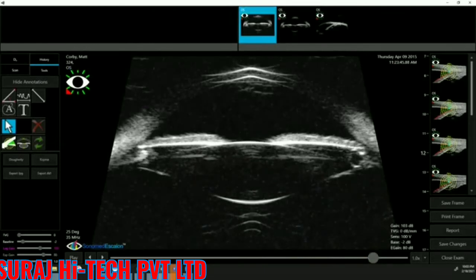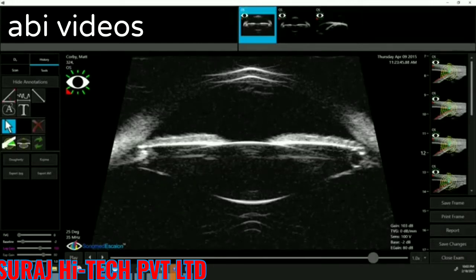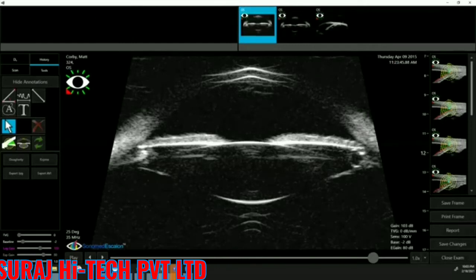I've been asked by some doctors, "How often do you see a ciliary body cyst?" I have never seen one. And usually a doctor who never used UBM has never seen one. But doctors who use ultrasound biomicroscopy usually say every second or third patient will have a ciliary body cyst.